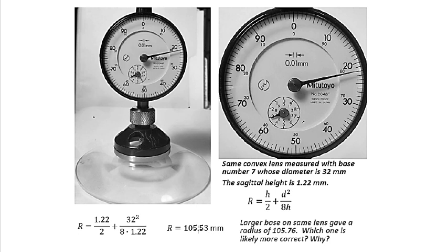So now you have to compare. When you use a larger base for the same convex lens, you get 105.76, and with a small base, you get 105.53. So we have to decide which one is more accurate or more correct, and why.